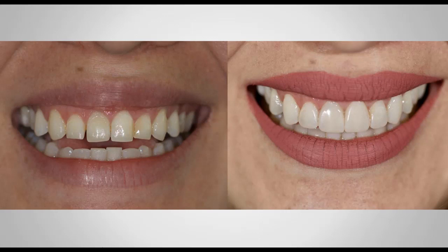So this was a live patient demo. What you're seeing before and after, that after photo was taken literally 10 to 15 minutes after the procedure was done. And one of the nice things, as you can see, you may ask yourself, how come the patient is smiling so naturally and her lips have not been affected by any anesthetic? Well, the reason for that is because I normally don't numb my patients to do these type of procedures.